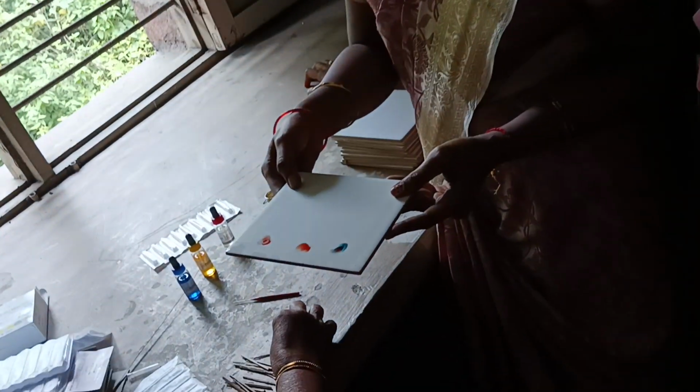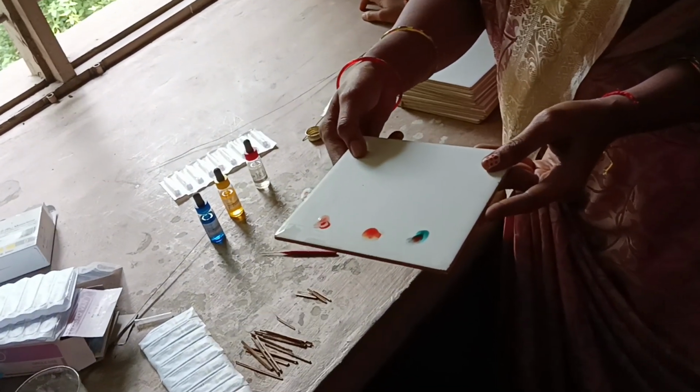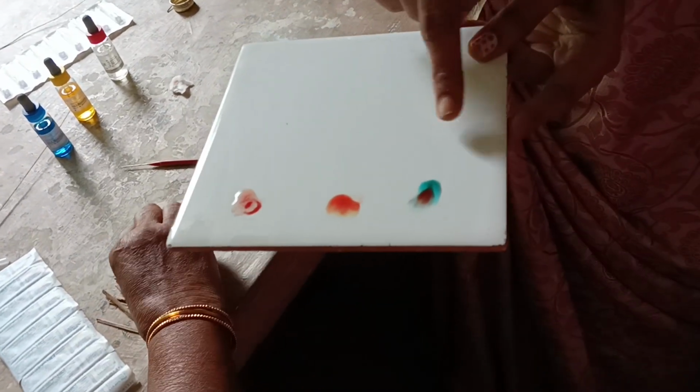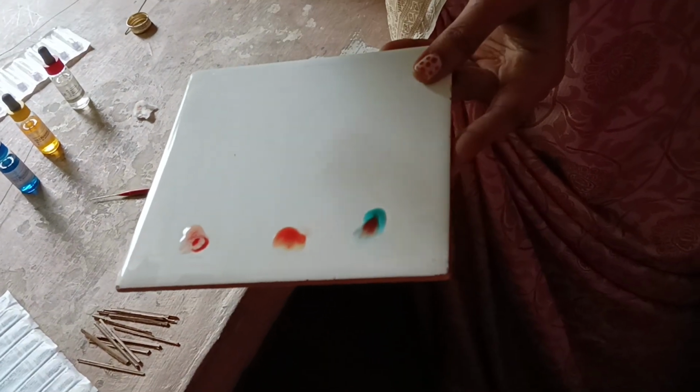It's in the B, you cannot see any agglutination. See, the blood is like that only. No agglutination. Okay, so this is A. We have added A, B, and D. So, A positive.